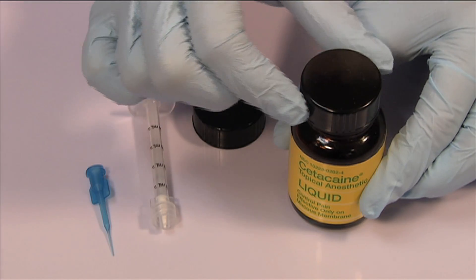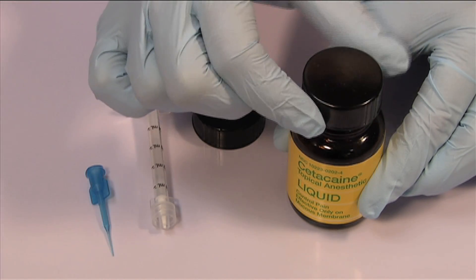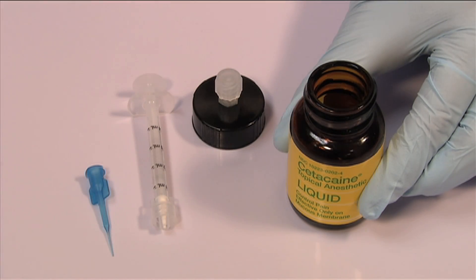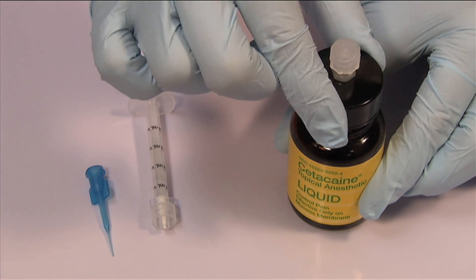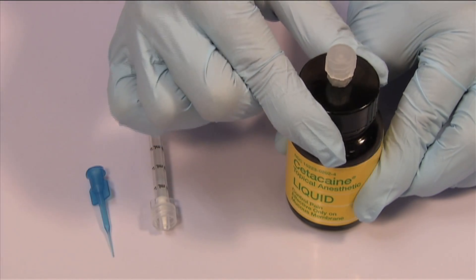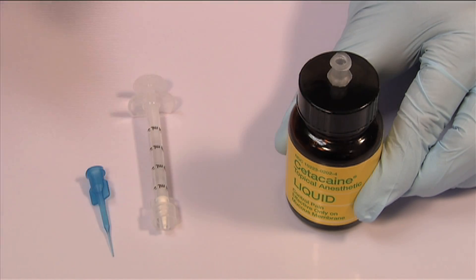To set up the delivery system, first remove the shipping cap from the liquid bottle and discard it. Replace the discarded shipping cap with the luer lock dispensing cap. Once in place, this cap should not be removed. Remove the small cap from the luer lock port and retain for replacement after use.